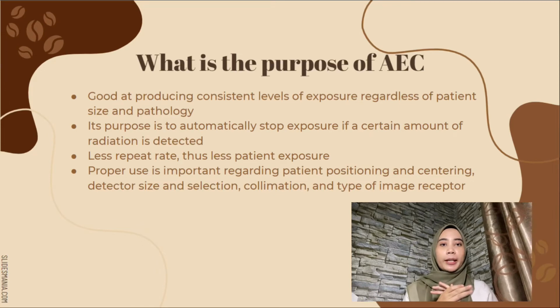Okay, now we already know about this AEC, so let me discuss the main purpose of AEC. Basically, AEC is very good at producing consistent levels of exposure regardless of the patient size and pathology. The other purpose is to automatically stop the exposure if a certain amount of radiation is detected.